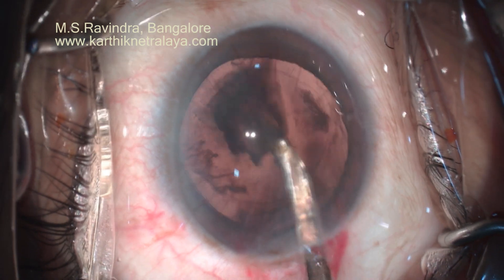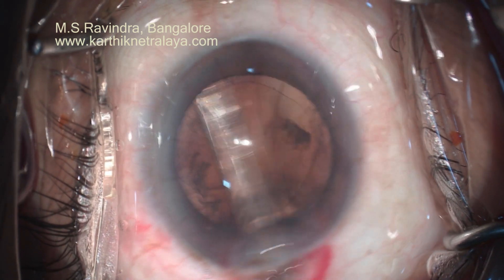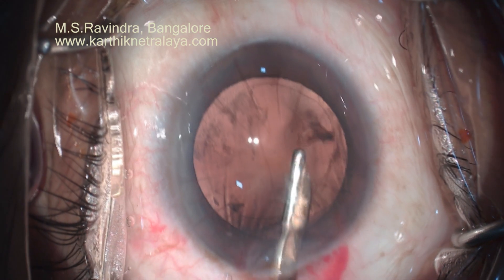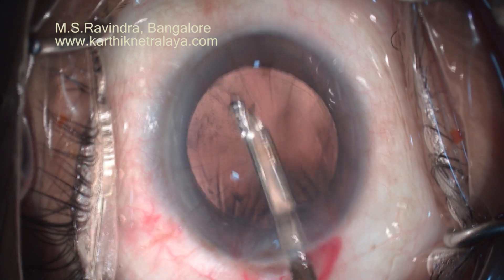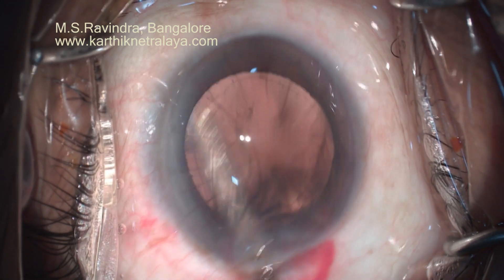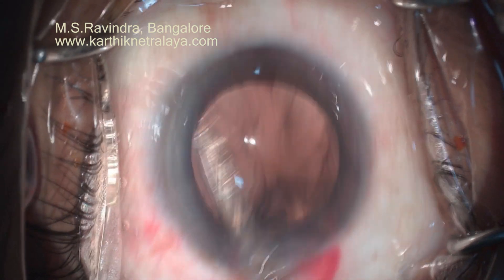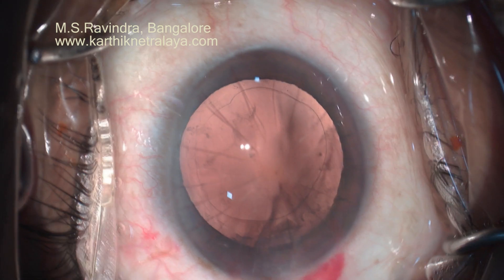The Simcoe cannula irrigates as well as aspirates the cortex, as you can see. Polishing has to be complete, and all cortical elements stuck to the capsule have to be aspirated, otherwise it will give post-operative inflammation which can be clinical or even subclinical.